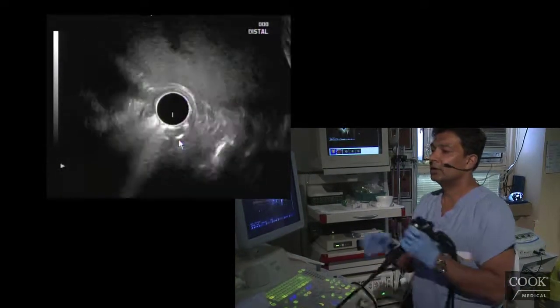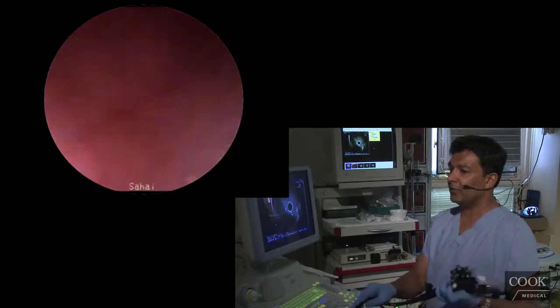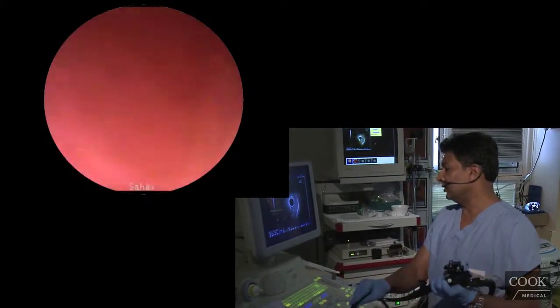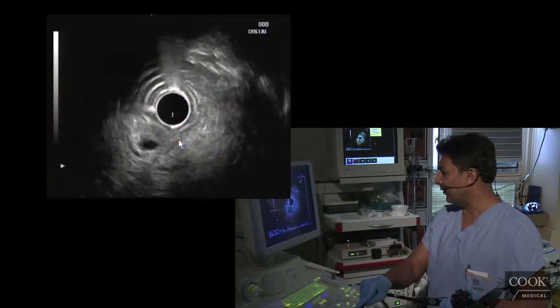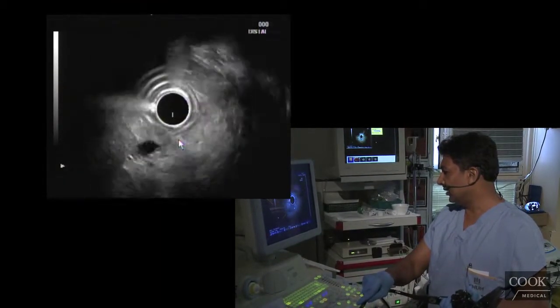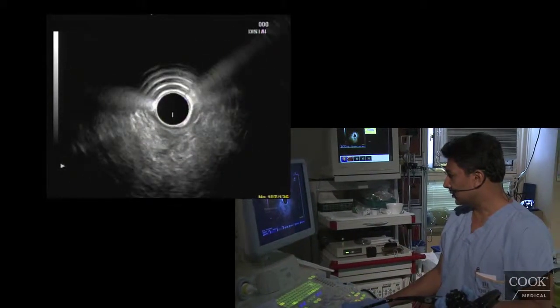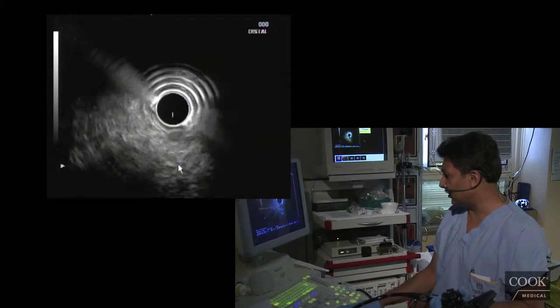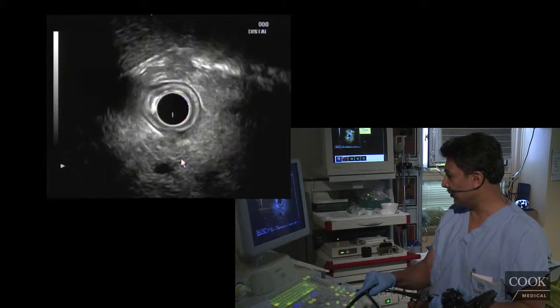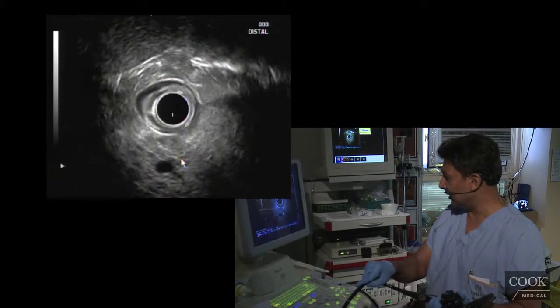We'll go underneath, in front of the papilla. I think it is important to get a view from in front of the papilla, because you can miss stones impacted right at the papilla if you don't do that. So I'm right in front of the papilla now. There's his ampulla right about here. I pull back — you see the PD comes out first, and then the bile duct right there. You get the view right to the papilla, and there's nothing there.